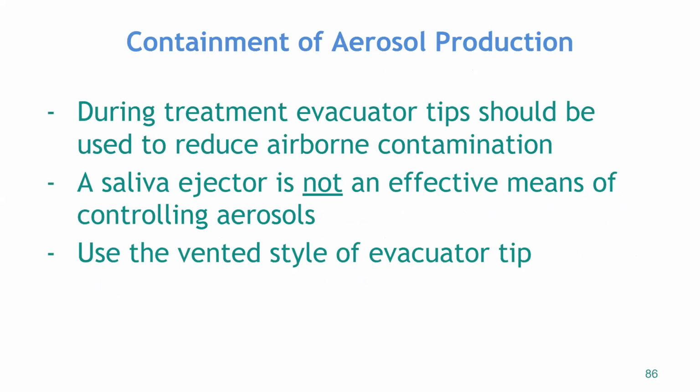So, during treatment, evacuator tips should be used to reduce airborne contamination. A saliva ejector is not an effective means of controlling aerosols. So, we need to use our HVE, those new mirror suctions. That's what those are for, containing our aerosols. So we use that with our handpieces when we're polishing. And then always, always, always when we air polish, we're going to use the HIVAC, and any ultrasonic instrumentation, we're going to use the HIVAC also.